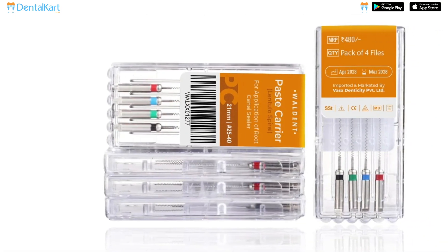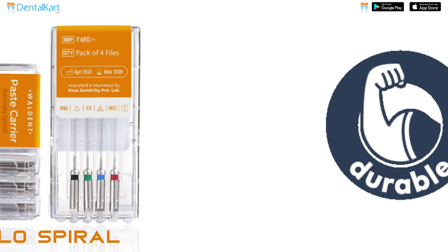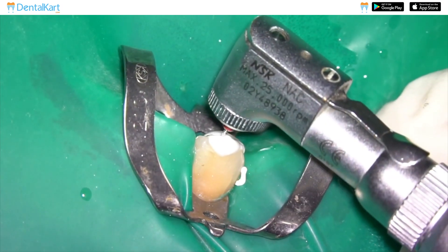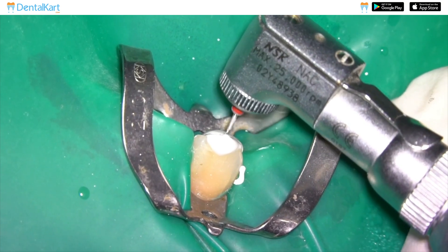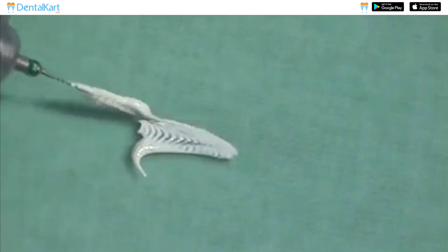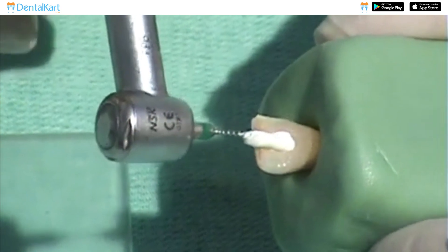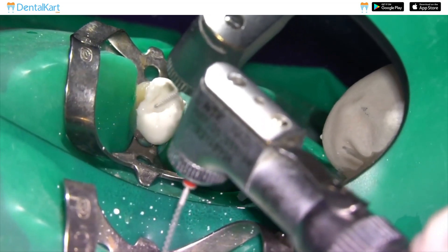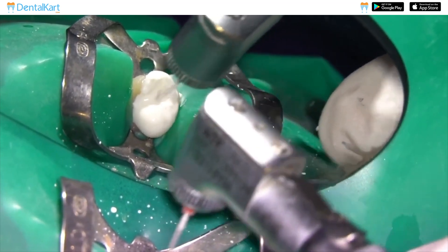The Walden Paste Carrier, also known as Lentillo Spiral, is a durable and sterilizable dental instrument used for the precise placement of root canal filling materials. Its spiral-shaped tip effectively dispenses dental paste or cement into the root canal, ensuring optimal coverage and sealing. Available in different sizes, it facilitates accurate placement for successful endodontic treatments.